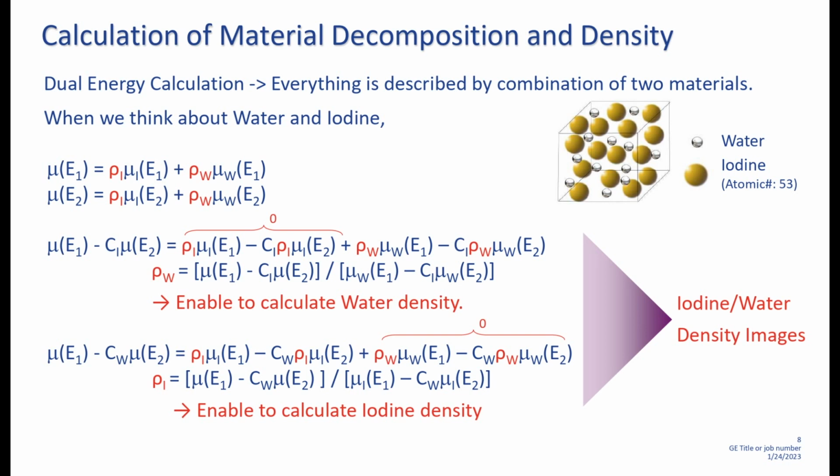Actually, we have done some cases also, GSI images, in that iodine is present in the vessels, but we were not able to differentiate between iodine in the vessel and lipiodol in the vessel. That was the problem. Both are iodine attenuation. If you suppress iodine, both will get suppressed. But we had fat also in lipiodol, so can this be... It's a mixture. It's a very small quantity mixture. It's very difficult to differentiate.